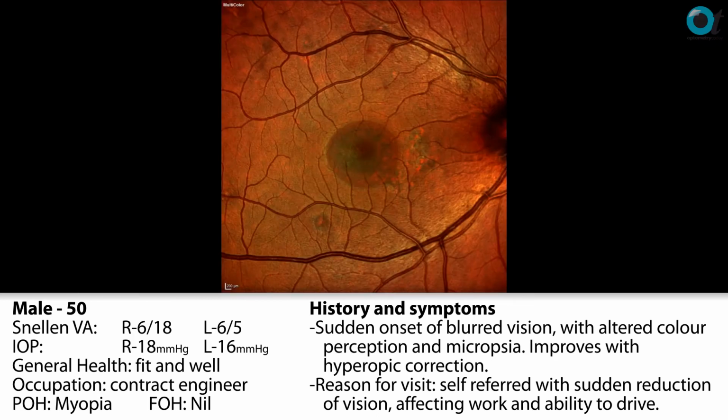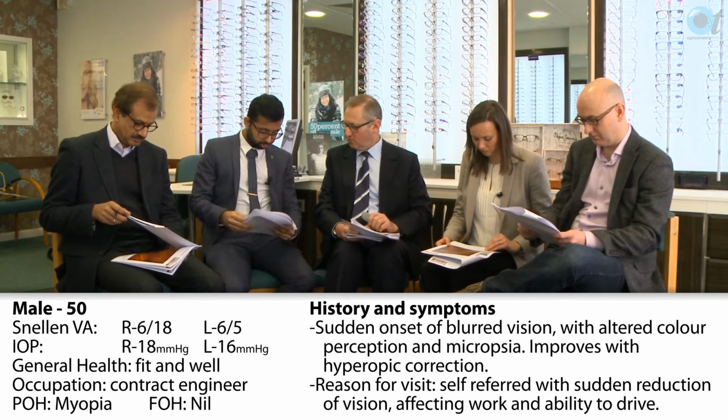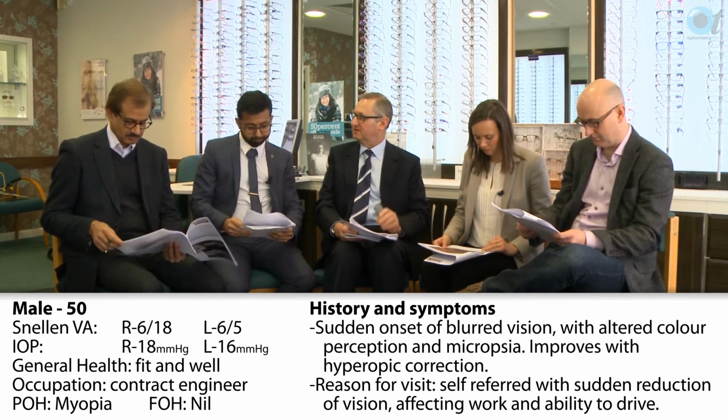That's good. Should we have a look at the fundus image? Do you think that the fundus image is completely consistent with the OCT image? Yeah, it definitely looks like central serous retinopathy on the fundus image. Okay, what other things could it be, do we think?